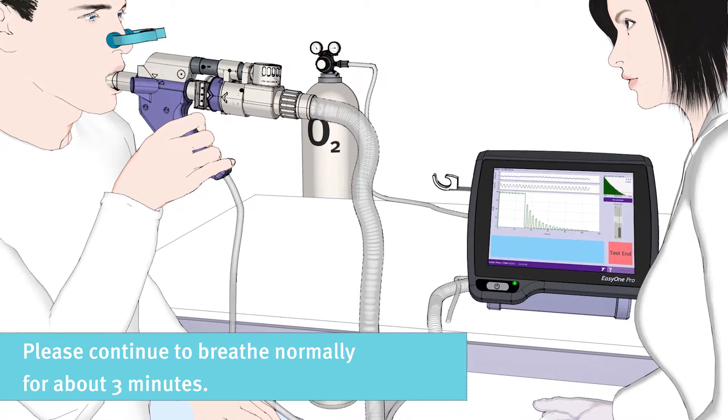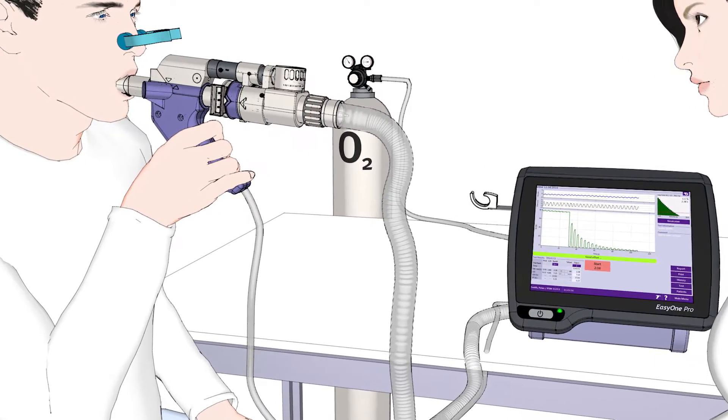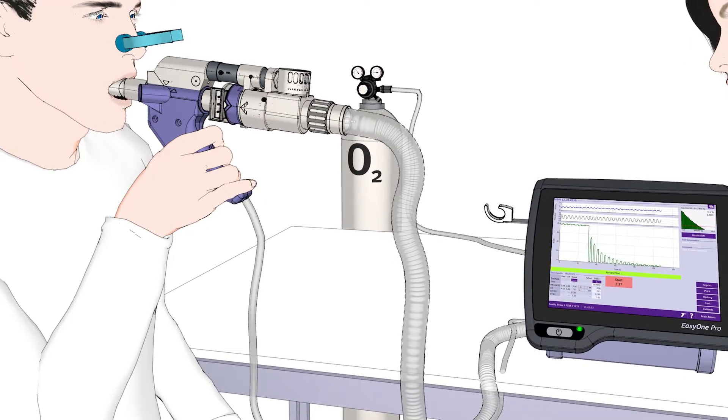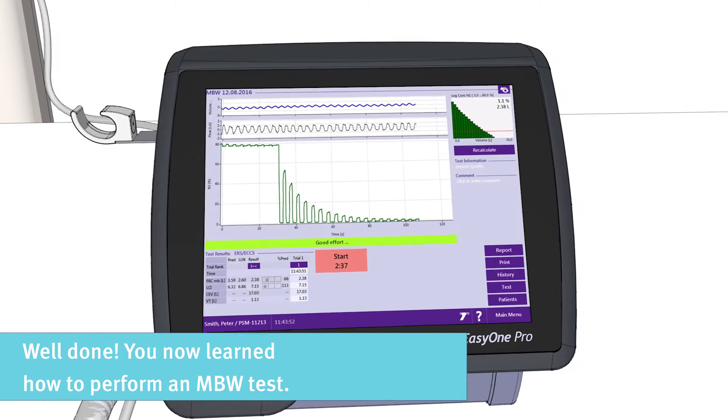This will take about three minutes. You have now learned how to perform an MBW test.